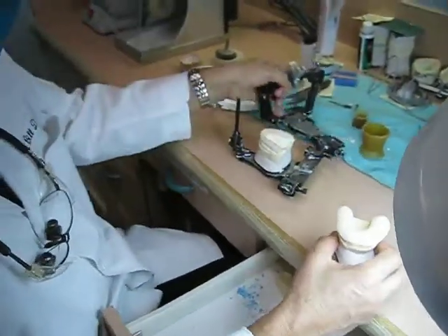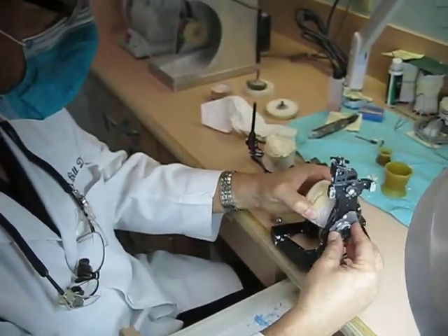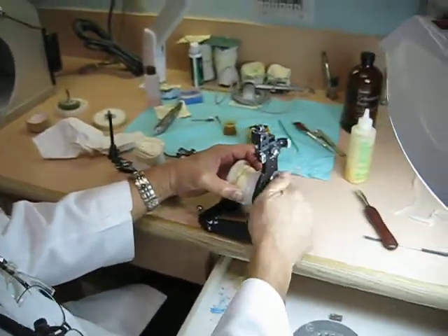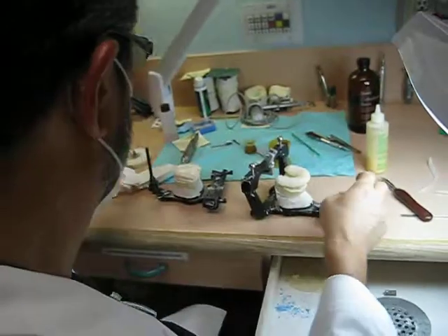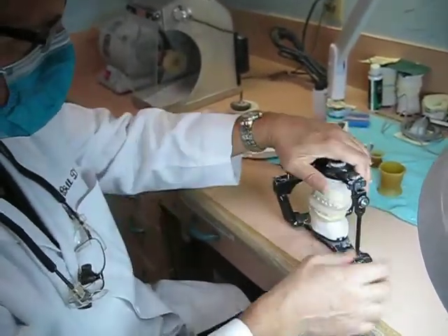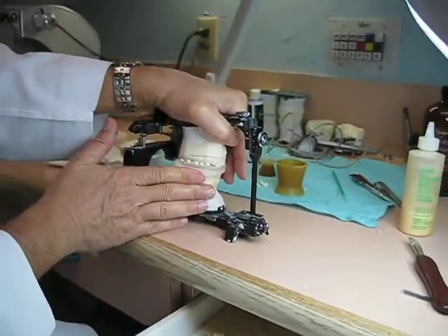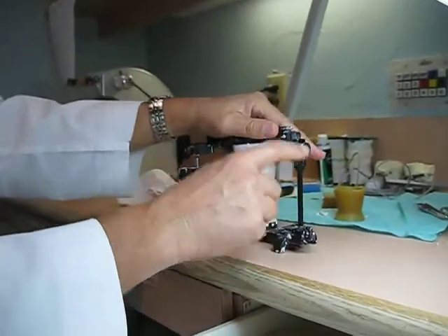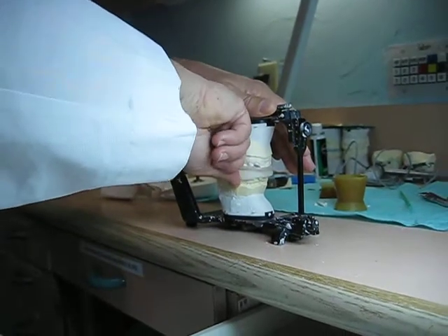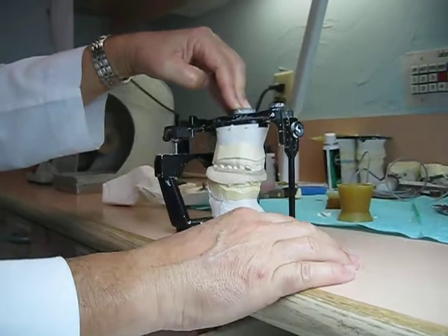So this is put back on the working articulator. Now, working articulators usually don't look fancy because they do a lot of model work in any given day. So they have stone on them, the paint will come off, all of this kind of stuff. So I wouldn't be concerned about the looks here. But right now, I am press fitting this material to that upper model on a programmed mechanical jaw.